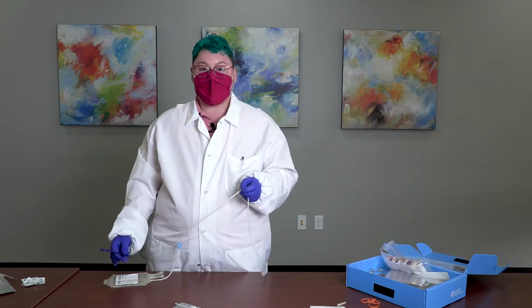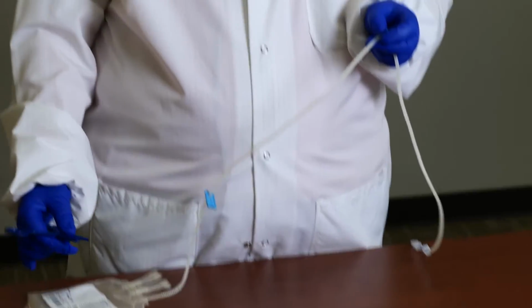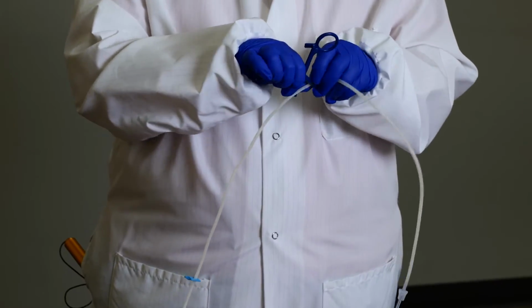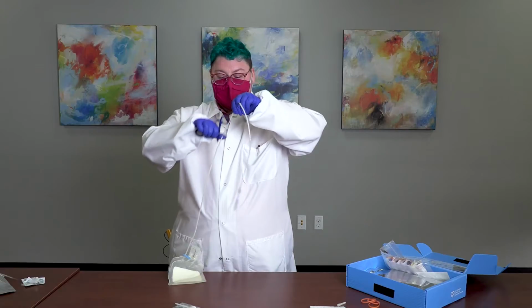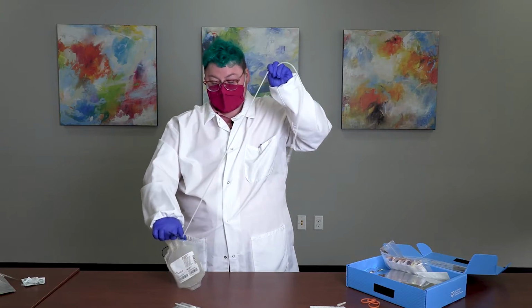The next step of the process is to strip the tubing. And the reason that we're doing this is to mix the anticoagulant that's in the bag with the blood that's in the tube. We want to make sure to get every single last cell from the tubing into the bag so that this can be used for a patient in need.